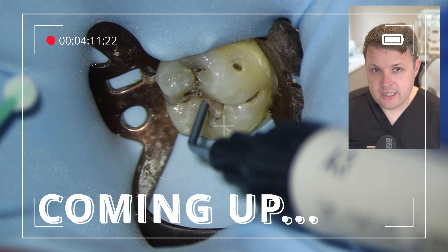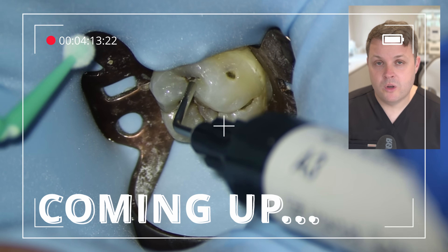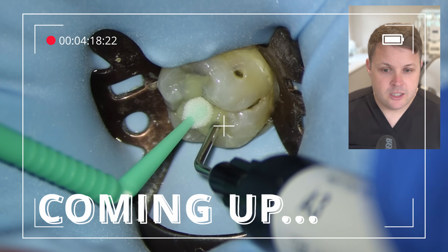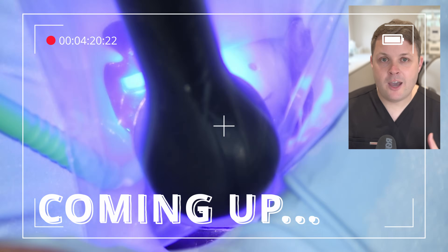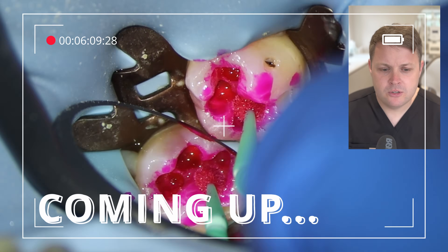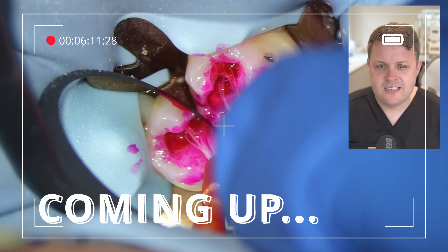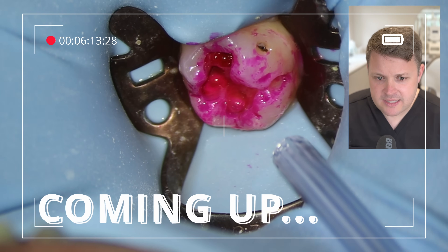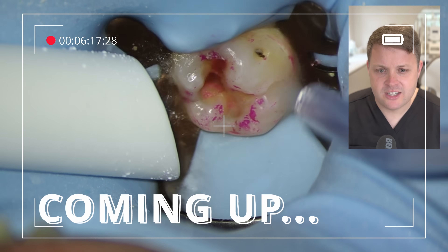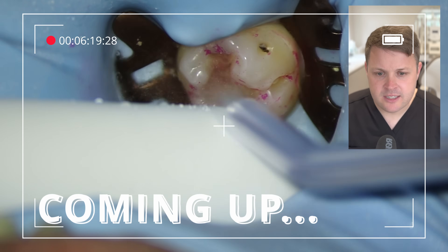In this case, I'm going to use a stamp technique. Essentially, we're going to flow some flowable composite into the occlusal surfaces of the tooth just to capture the occlusal anatomy. When we wash away the caries detection dye, we can see it's stained at the occlusal surface.